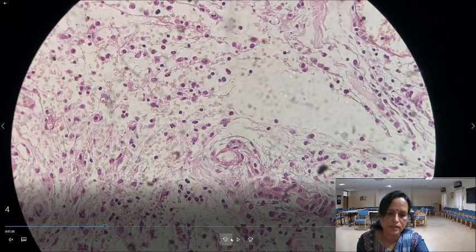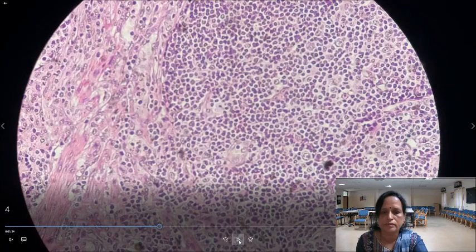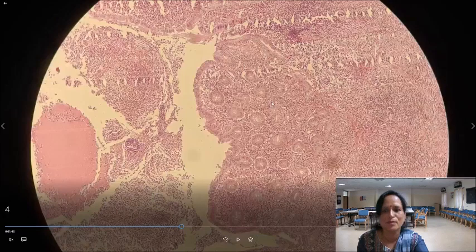See, this is a mucosa. It is a lymphoid follicle coming towards the mucosa, mucosal glands, then the purulent material. Very classical slide of acute appendicitis. See the lymphoid follicle, so the lower power view, mucosa, submucosa. So lumen, exudate, the mucosa.